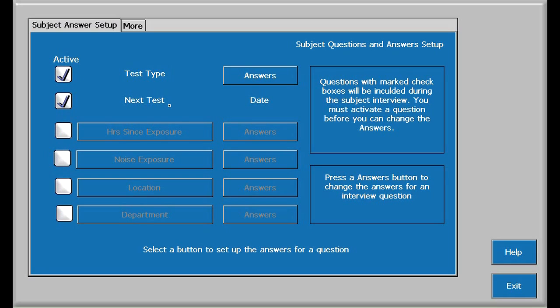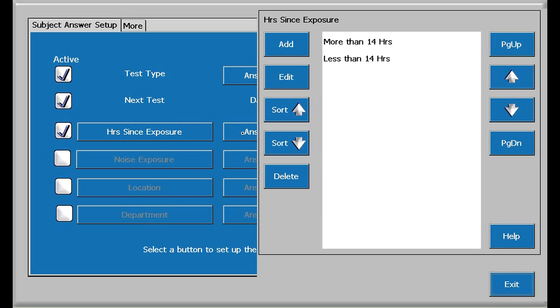The remaining thirteen Q&As can be modified. Let's touch the third Q&A, Hours since exposure, as an example. The question is, how many hours has the employee not been exposed to work-related noise? Touching answers shows two possibilities, more than fourteen hours or less than fourteen hours.